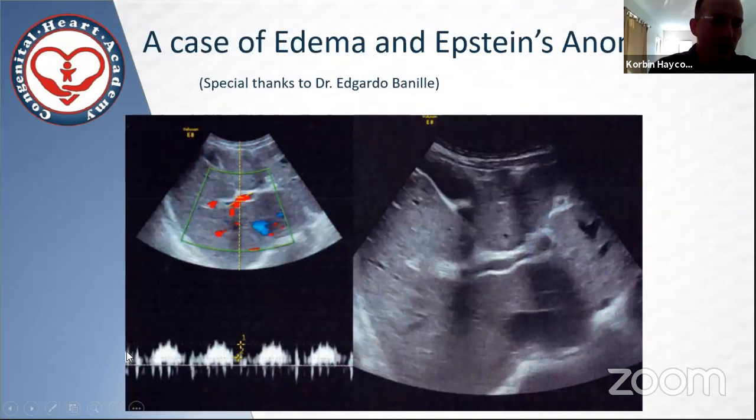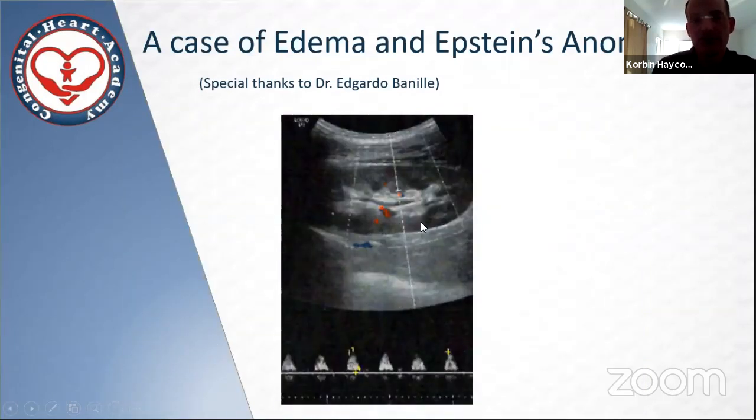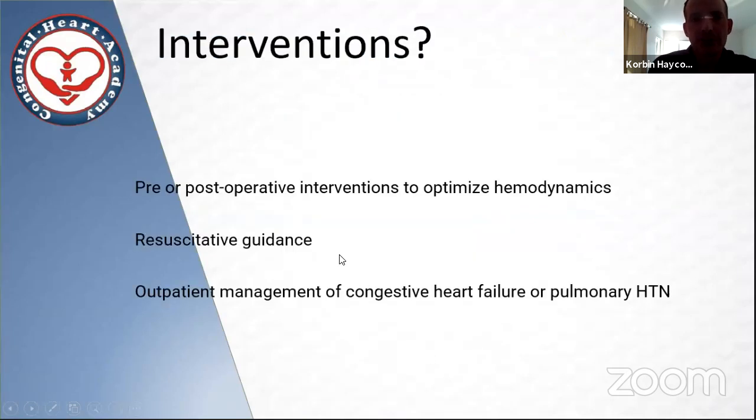Now with this in our VEXUS scheme, we already are a VEXUS 3 score, which is the most severe. However, if we look at the intrarenal venous Doppler, we also have a severe flow abnormality there too. So doing this exam made them suspect that this was a new onset cardiorenal phenomenon, and the venous congestion was the cause of the kidney dysfunction and the edema. The patient then had diuretic therapy and had a significant improvement in their clinical status.